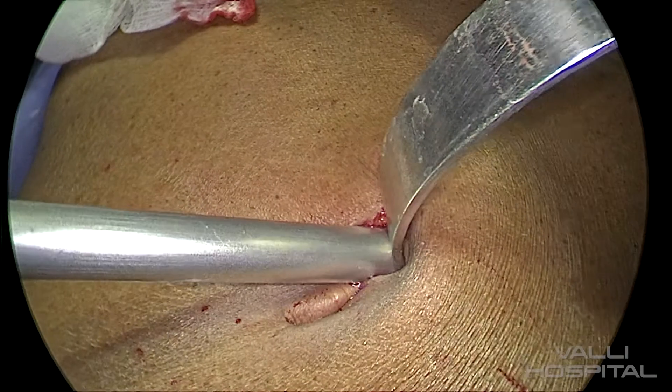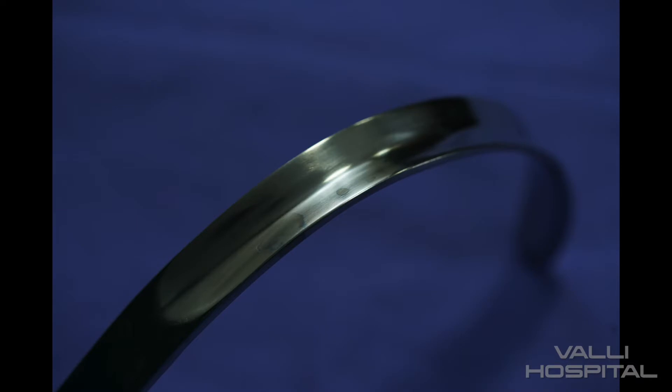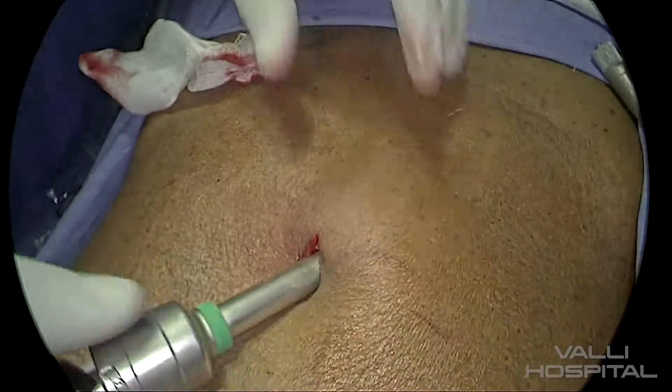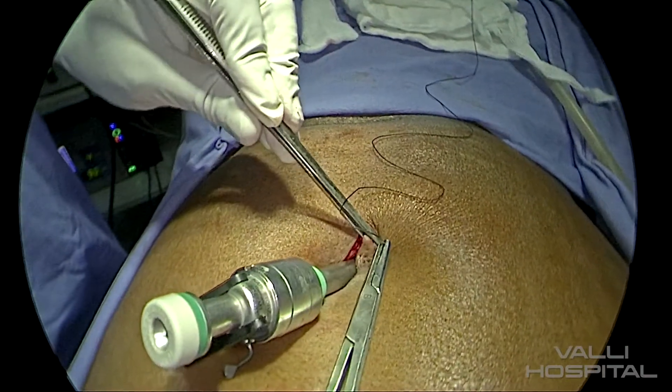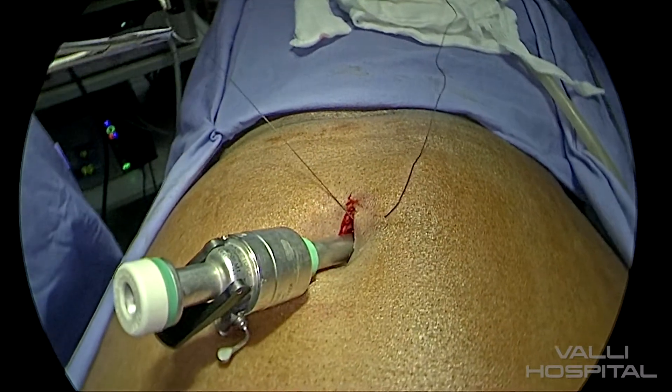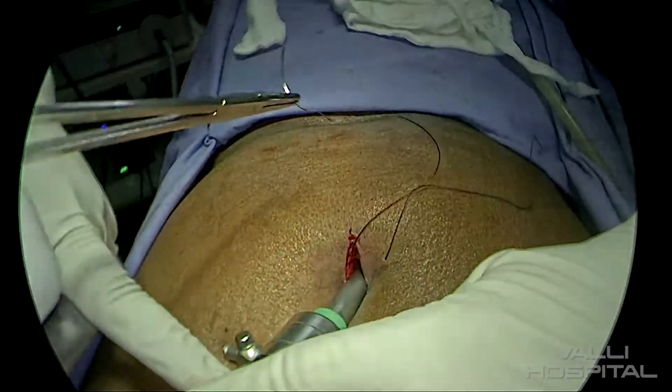Then take the beveled trocar and push it inside. While taking the retractor, it might be difficult — for that, we have designed the retractor with a depression in the center so that it can glide along the trocar without any difficulty. The best tip is to use a smaller retractor; if you use a smaller retractor, it will be easier. After inserting the trocar, you have to close the wound, because the wound is a little bigger than the trocar. Otherwise, the air will escape.